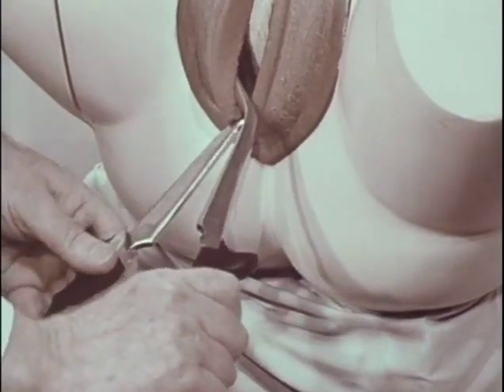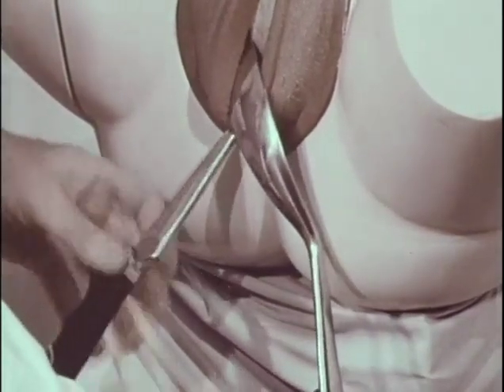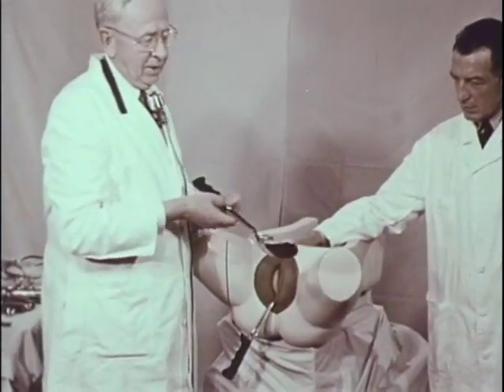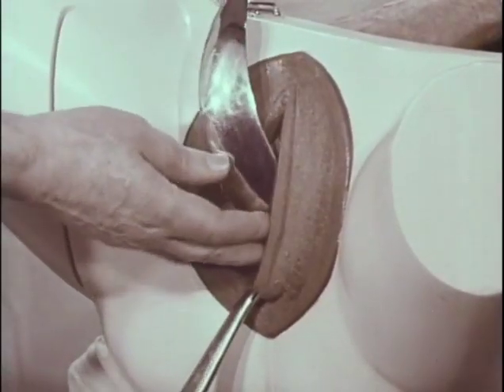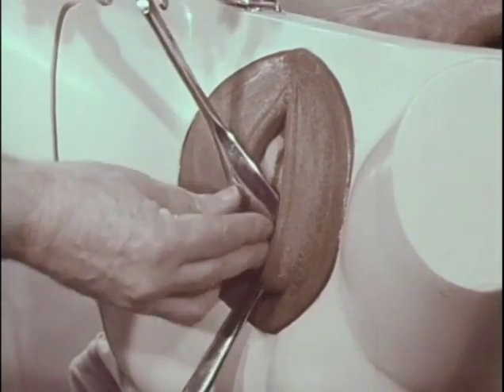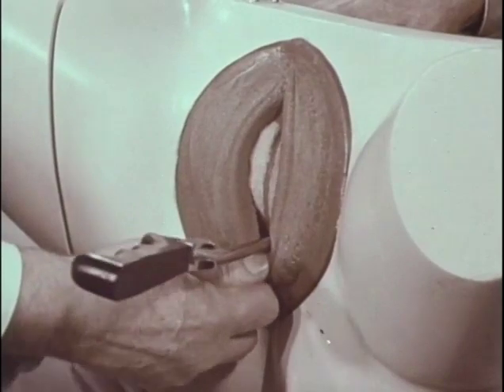Unlock, remove in a downward direction, because that's the direction of the pelvic curve. And the top blade is removed first. Gently. And it is reinverted and found to be the left blade, the one necessary for the reapplication in the new left-sided LOA position. It's held in the left hand, inserted to the left side, inside the splinting blade, between it and the posterior parietal bone. Then the splinting blade is removed, similarly in a downward direction.